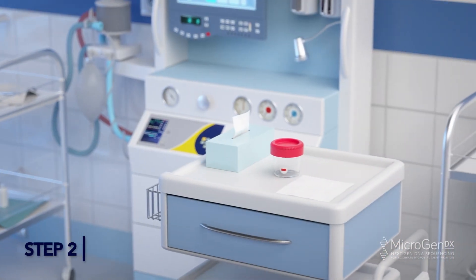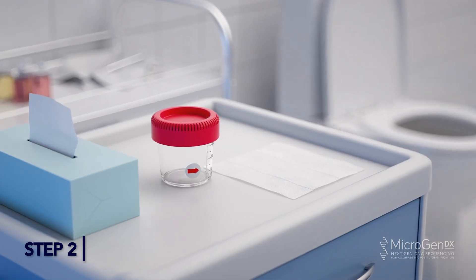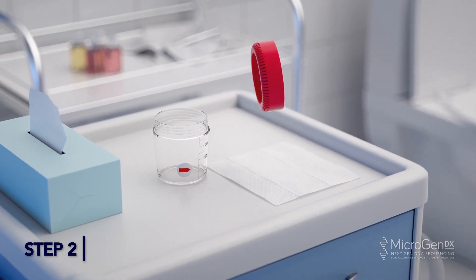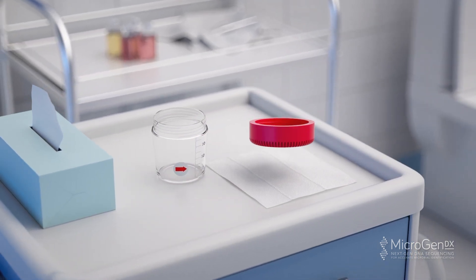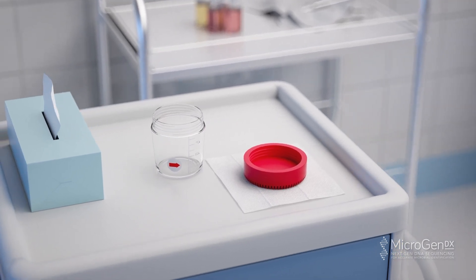Step 2. Spread a clean tissue on a surface close to the toilet bowl. Remove the lid from the urine cup and place it topside down on the tissue. Place the open urine cup next to the tissue, being careful not to touch the rim of the cup or lid with fingers or body surface at any time.